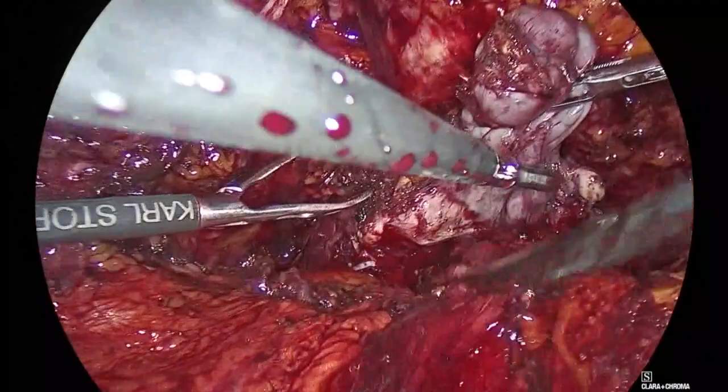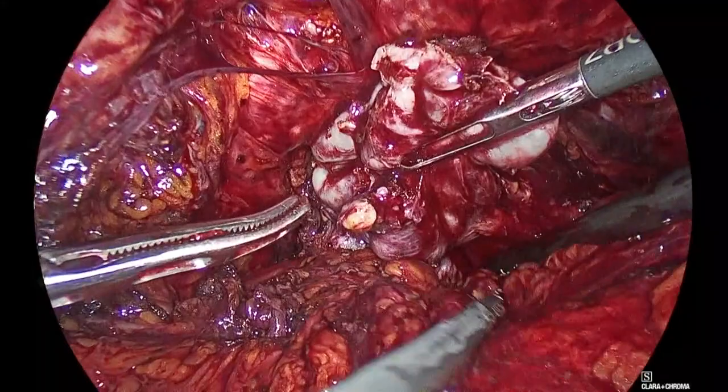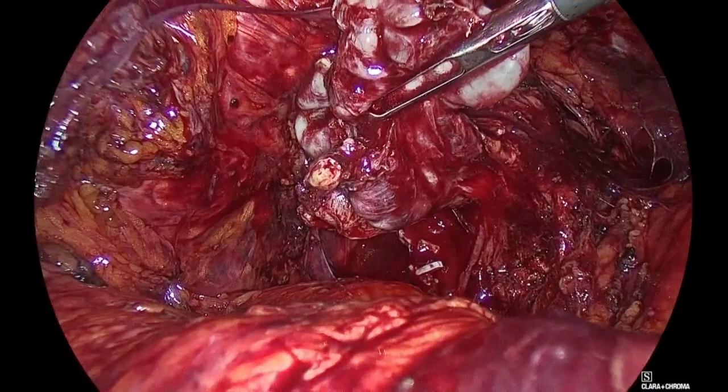My side. And then if the tissue is hard, hold this. If you have this problem, then give me a harmonic and a strong grasper in my other hand. Good. If you have this problem, you just need to make a window. You need to make a smaller bite. So that's what you saw when I started doing it.